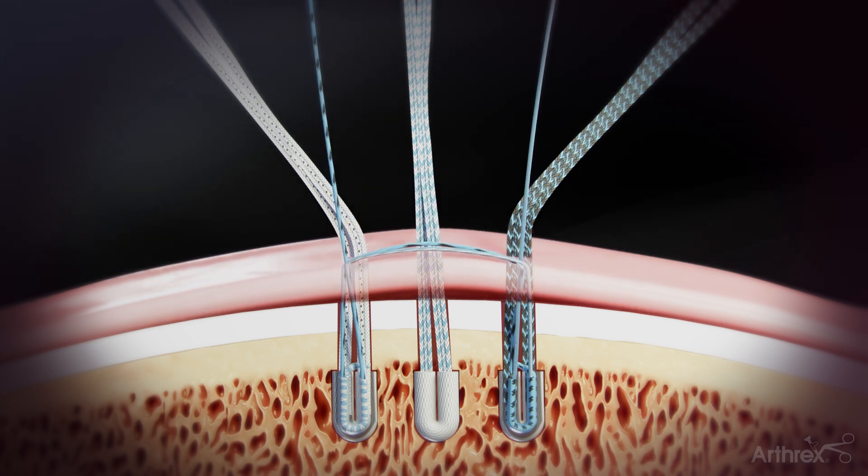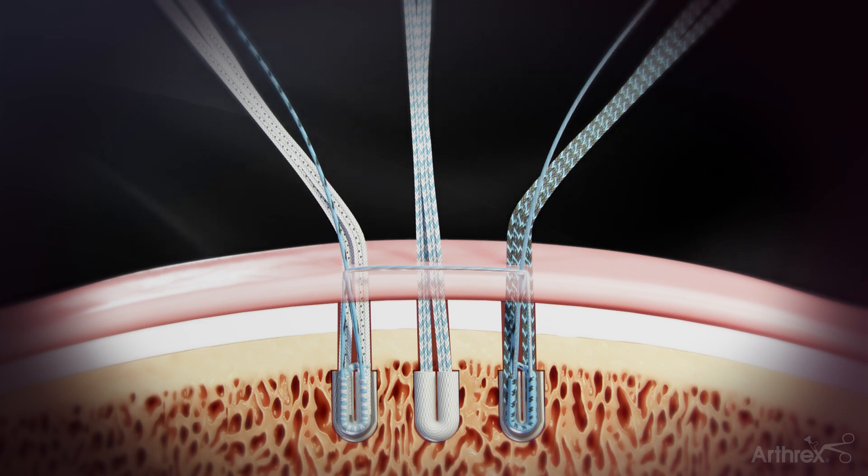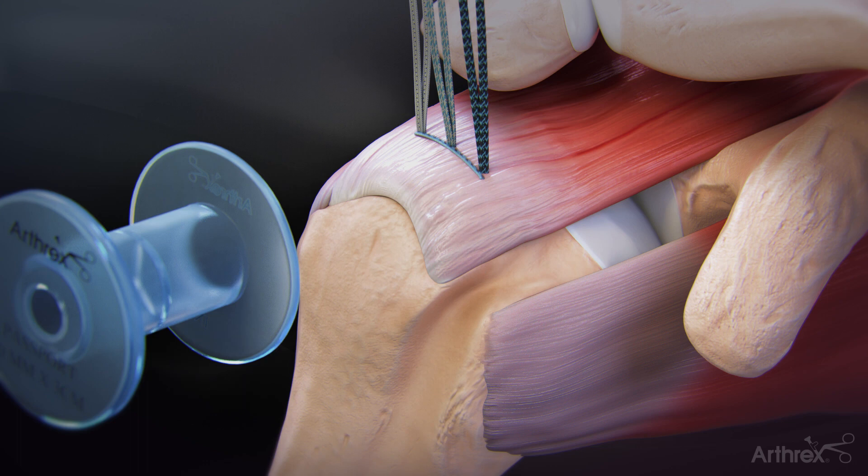Tension the two repair sutures to reduce and fixate the tendon down to bone, creating a medial seal. Cut the repair sutures flush to the rotator cuff once adequate fixation has been achieved.